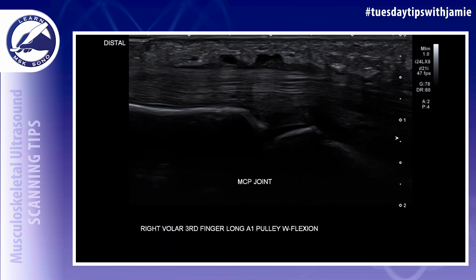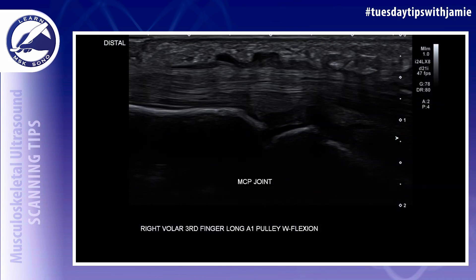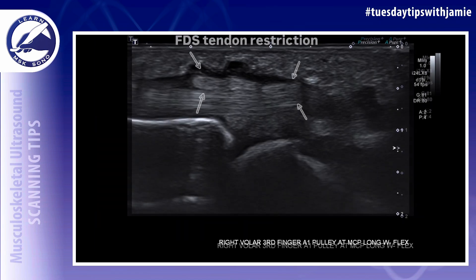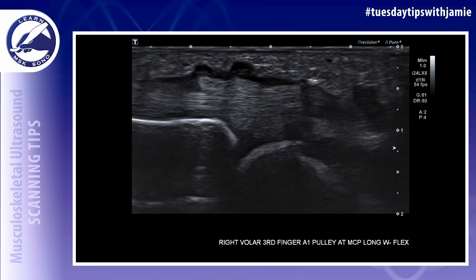A real-time dynamic evaluation of the flexor tendons during finger flexion should be performed to see if the tendons get restricted by the thickened A1 pulley during finger flexion.